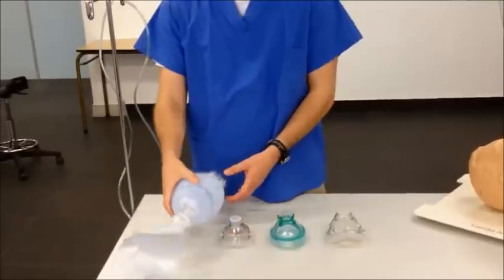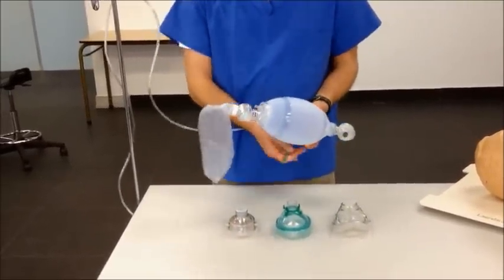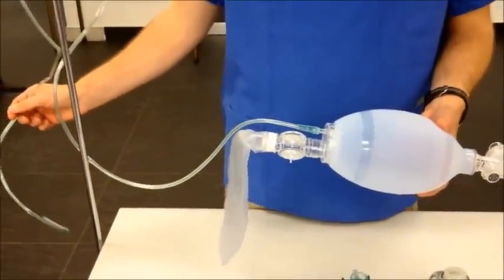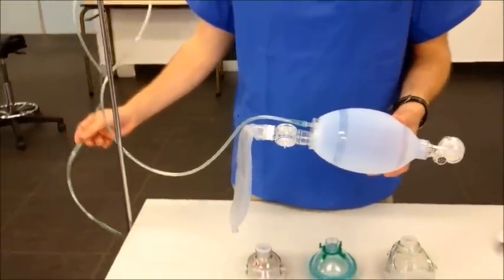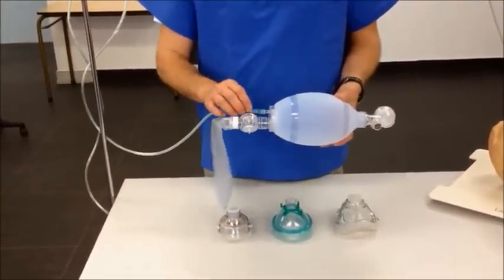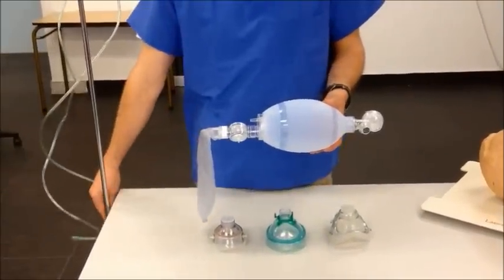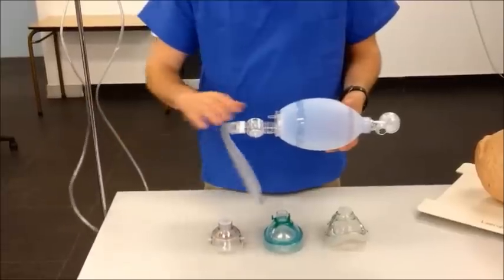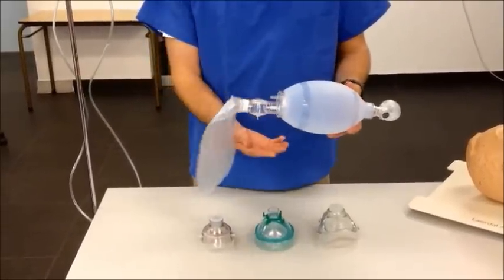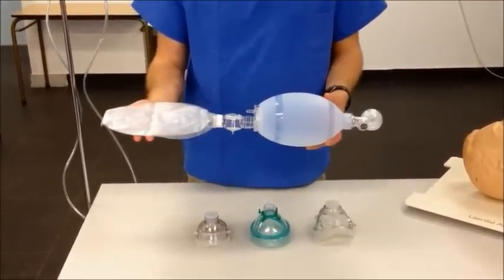If we start with the ventilation device itself, oxygen tubing should be connected at the oxygen port at the rear of the device, and then connected to wall oxygen at high flow of at least 15 liters per minute, enough to keep the reservoir bag inflated at all times. For demonstration purposes I'm going to remove this now, but please don't remove it during actual ventilation of the patient. The reservoir bag attaches to the rear of the self-inflating bag device and should be filled with high flow oxygen at all times to ensure delivery of high concentration of oxygen to the patient.